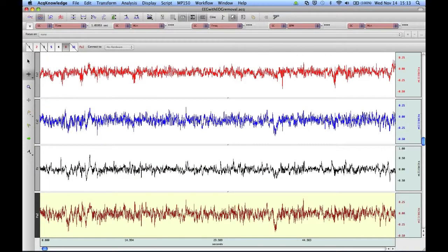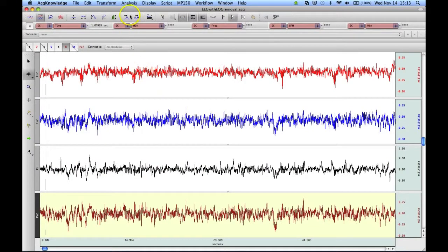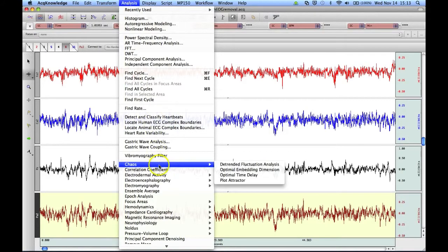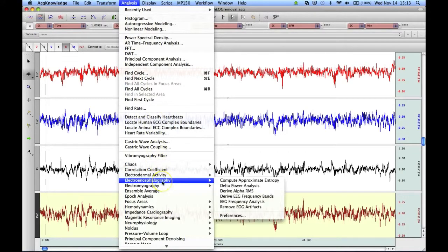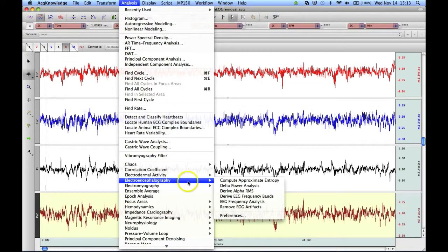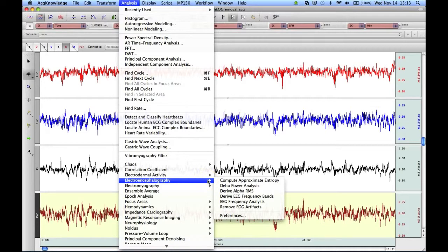To take advantage of the new Multi-channel Select option, go to the Analysis menu, scroll down to the Electroencephalography menu, and then select the analysis routine you're interested in.